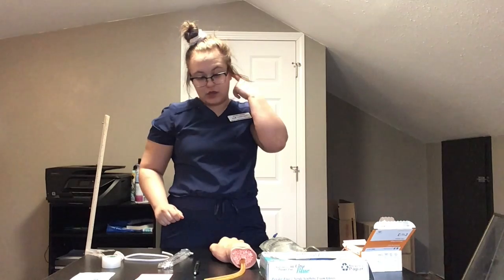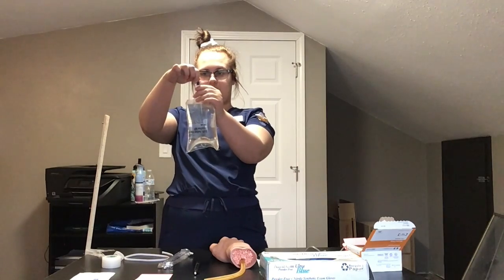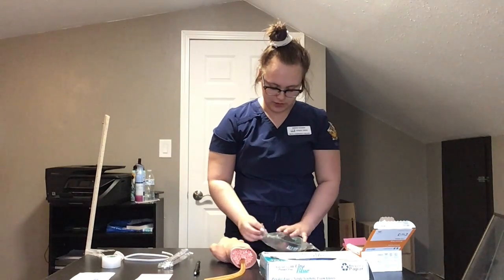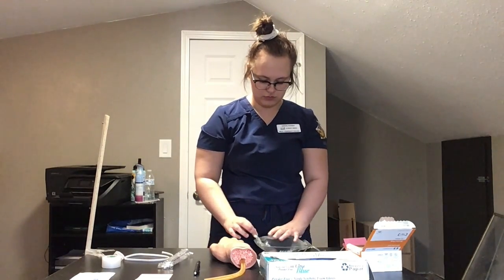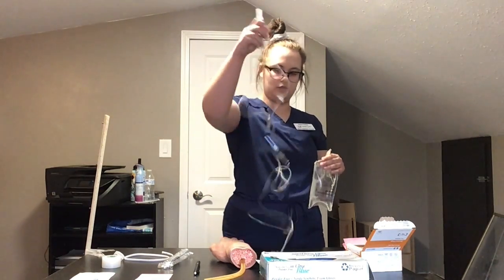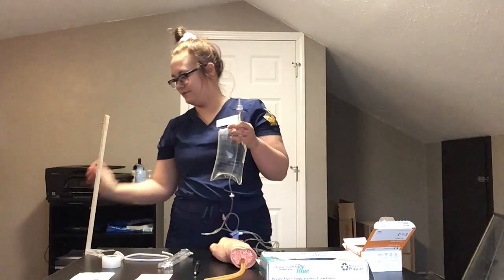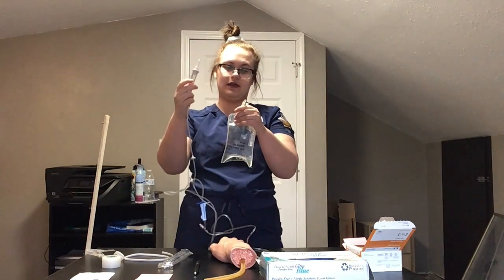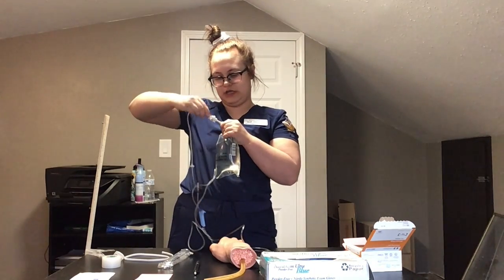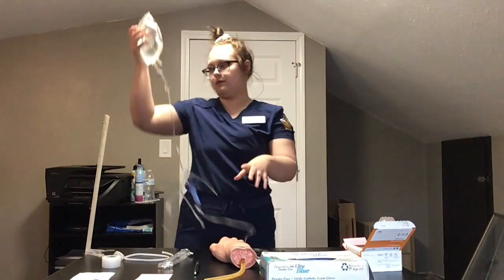So now that my tubing is ready, I'm going to take this safety catch off of my IV bag. Throw that away, and set this right here. Please don't leak on me. Oh, it's okay. And I'm going to get my spike for my tubing, and I'm going to take the cap off of the spike, and I'm going to make sure not to touch either one. Throw that away. Then I'm going to put the spike inside the IV bag, making sure not to touch it and to maintain sterility. And then once I get that in, I am going to hang it.